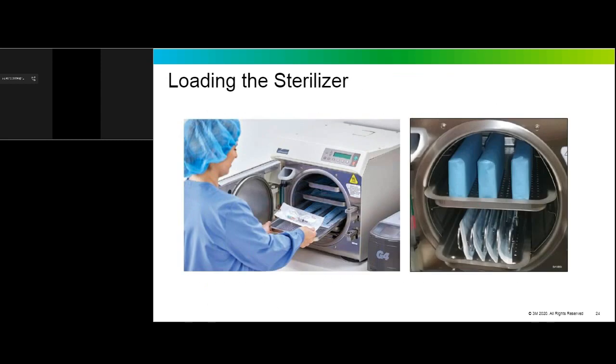So related to that, but this time talking more about the sterilizer, I wanted to touch on another responsibility, and that is to load that sterilizer as recommended in the sterilizer manufacturer's user manual or operator's manual. Again, something hopefully that is available to frontline staff. And you want to think about loading, because we talked about the fact that those critical variables need to be present, and we need to get the air out of the way, right? So proper loading will help facilitate air removal from the chamber and the load items, allow steam contact with all those load items, and then facilitate drying at the end of the cycle.